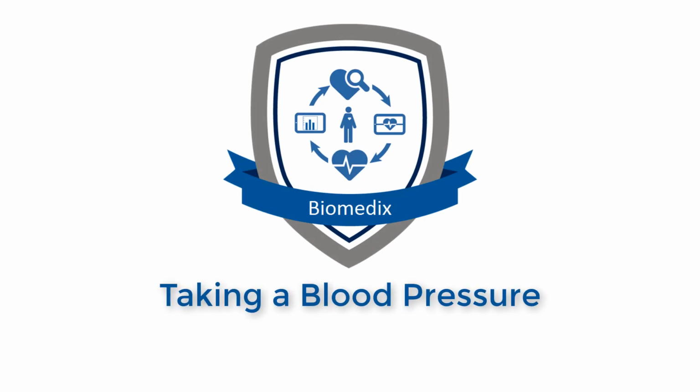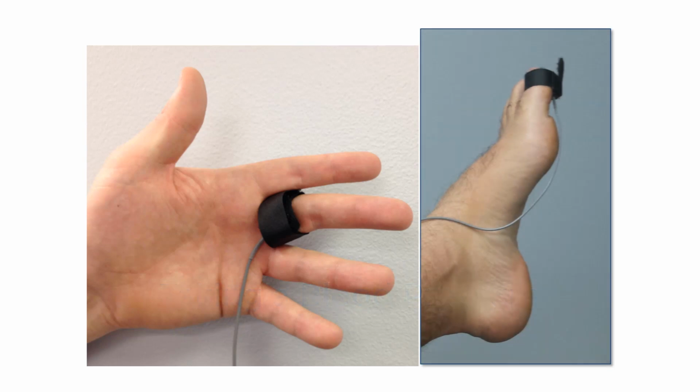In this section, we'll discuss obtaining a blood pressure. The PADnet uses a photoplethysmography or PPG probe to capture blood pressures. Blood pressures are taken at the arm and at the ankle. For blood pressures at the arm, the probe is best placed on the first segment of the pointer or middle finger, close to the palm.